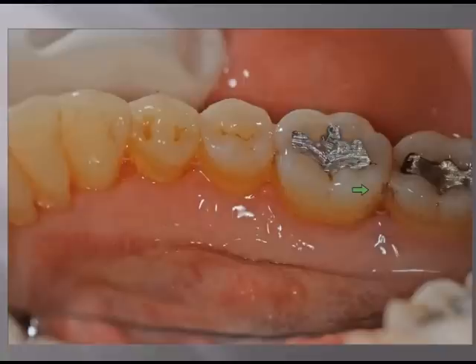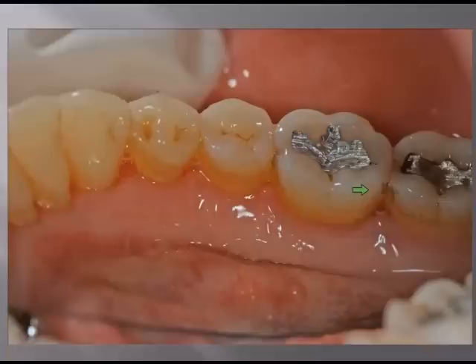We've seen some clinical slides, but let's see what's going on underneath. The next set of slides will show X-rays and probing depths, and how LANAP can help decrease pocket depths to much more maintainable levels. This X-ray is from one of my first LANAP patients — probably about three months after I received my laser and had my training. But these are the type of results you can get straight out of the gate. It's a very specific protocol: follow the protocol and you get the promised results.